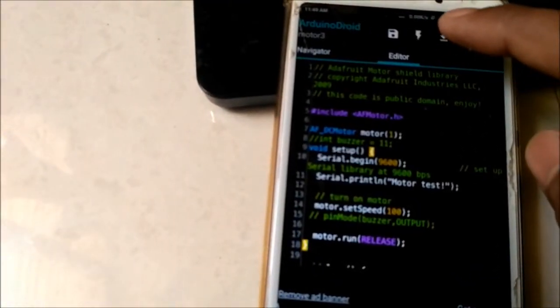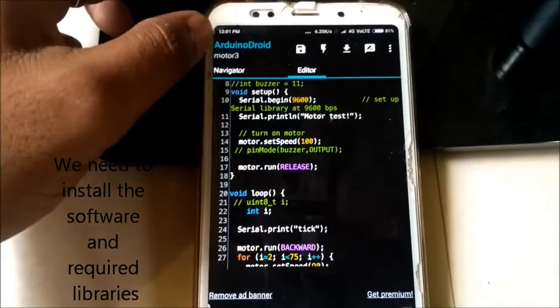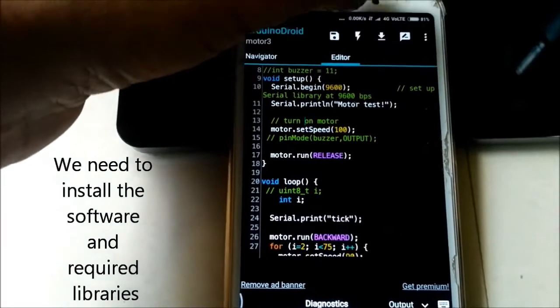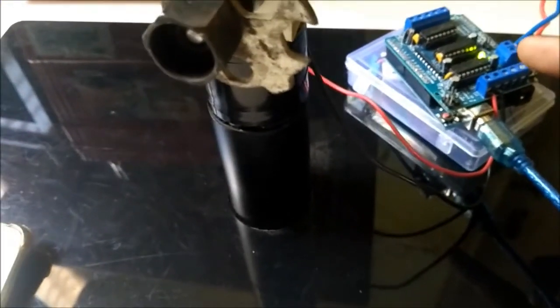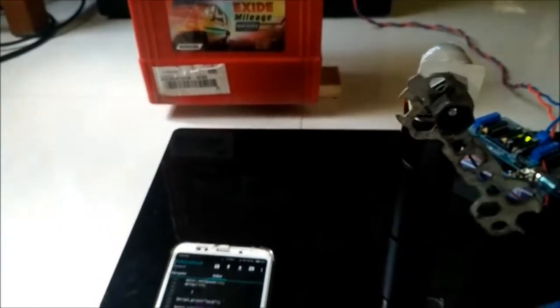You can see here it has been compiled. Now we'll try to upload this. Once the program is compiled, we need to upload this to the microprocessor. Once this is uploaded, the code has been fed to the microprocessor, which in turn gives a signal to the motor controller, which drives the DC motor here. Let's see how this works. Here you can see how the motor is being operated.